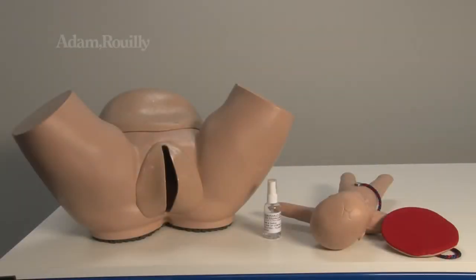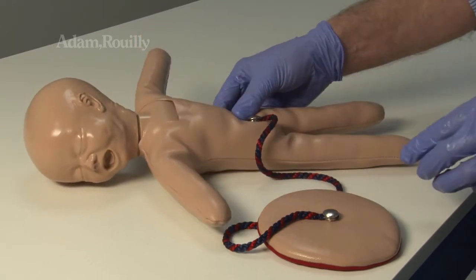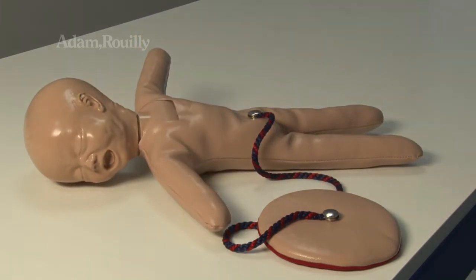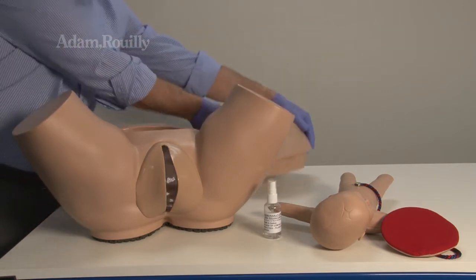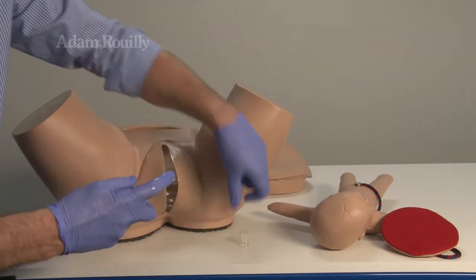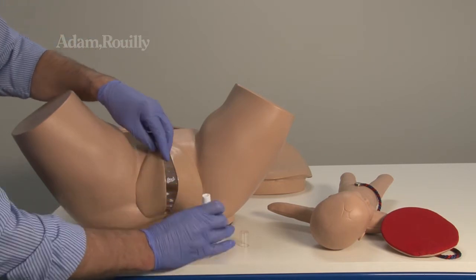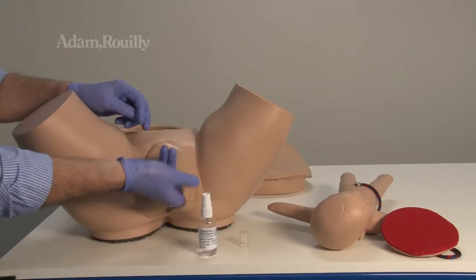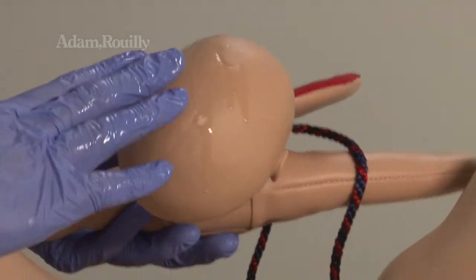Before use, detach or attach the placenta from the foetal doll as required. First, remove the abdominal wall cover. Apply lubricant to the model and to the foetal doll head.